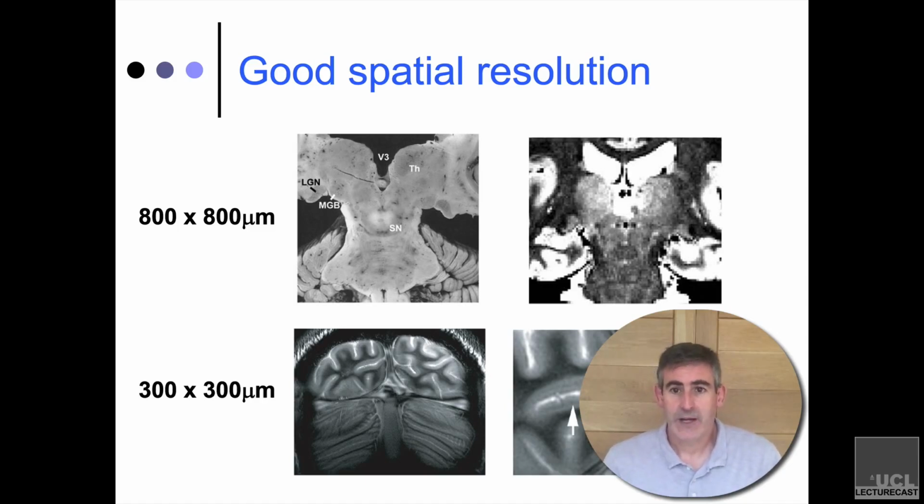Now, what I've described up to this point is just magnetic resonance imaging, MRI. There's no functional part of this. What this does is it gives you a really nice picture of the anatomy, and it relies on the fact that you can have very good spatial resolution.